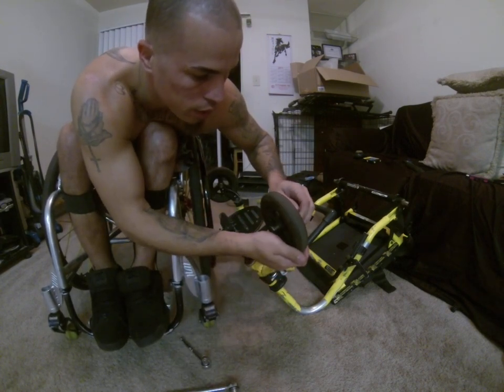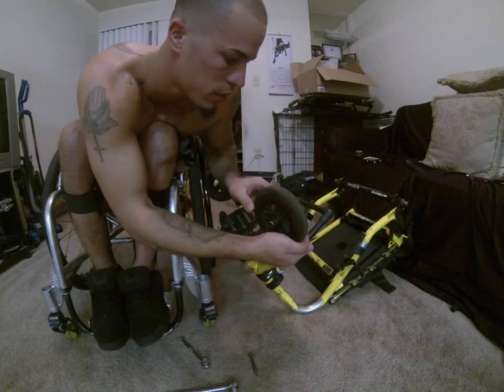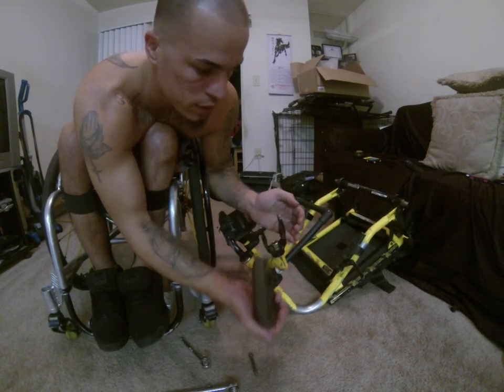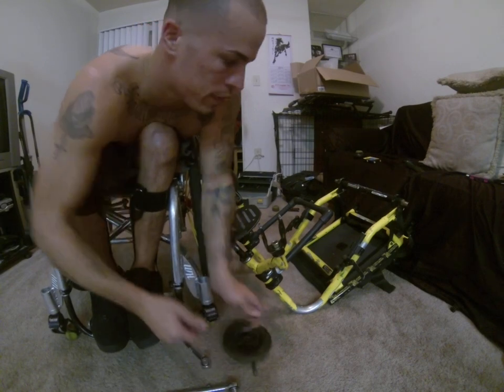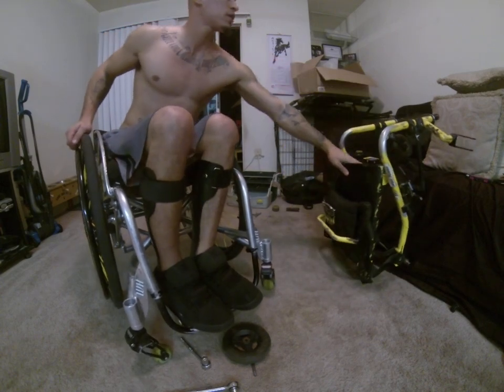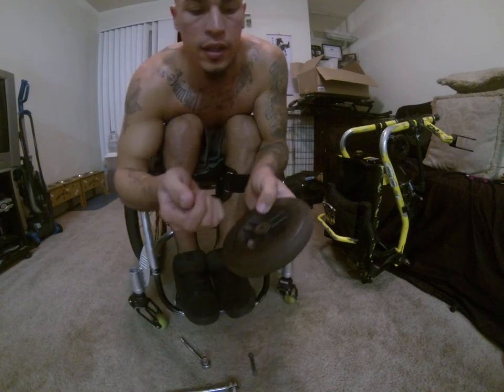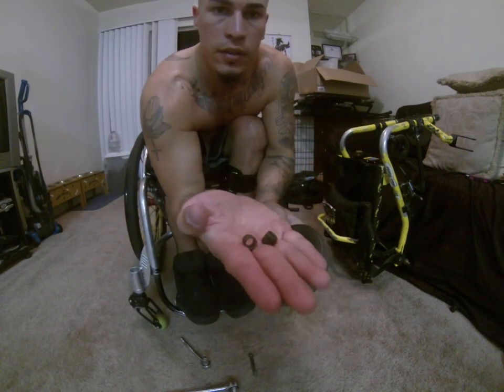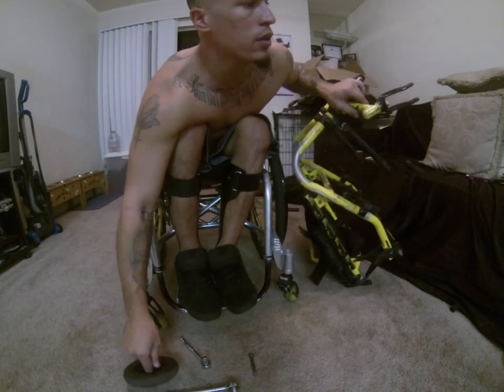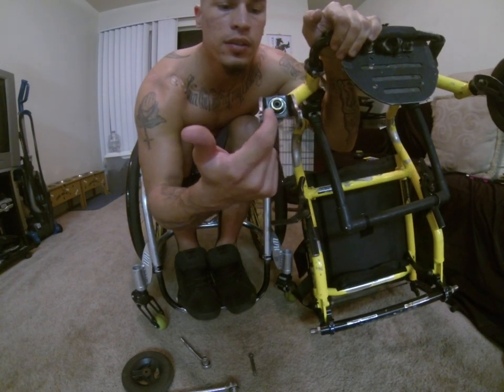Pop that out. Alright, when you pull this out, you're going to have a couple washers and stuff. Be careful they don't just fly out everywhere. Don't lose them. You're going to need the spacers. So that's it. It only takes a few seconds to pop right off. So what you're going to find inside, you're going to find two spacers. That's to keep the wheel from rubbing on the fork, keep it from rubbing on the inside of each other.